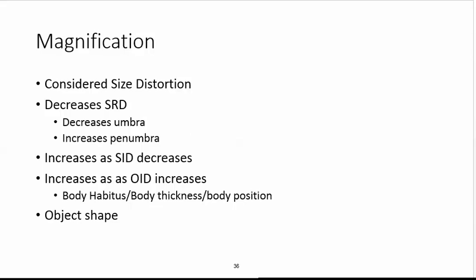We said that if we shot our wrist bones AP instead of PA, because of the shape of the bone and the divergence of the central ray being more similar to the shape of the wrist bones, we would reduce magnification and reduce penumbra. In other words, it would be better to shoot AP than PA because of the shape of the bones.